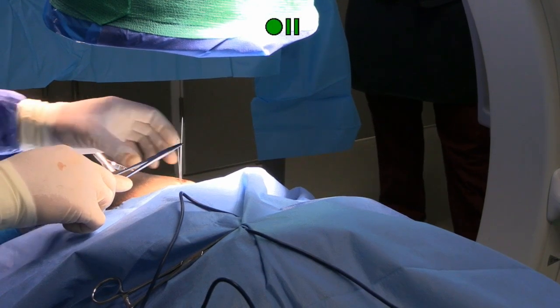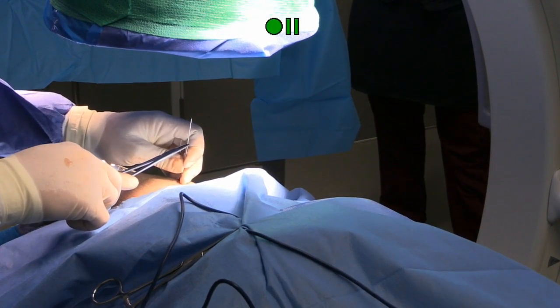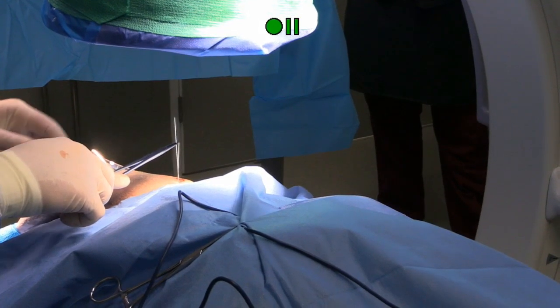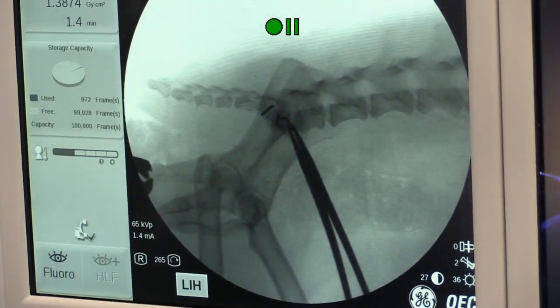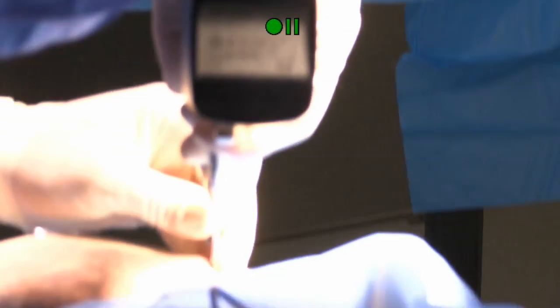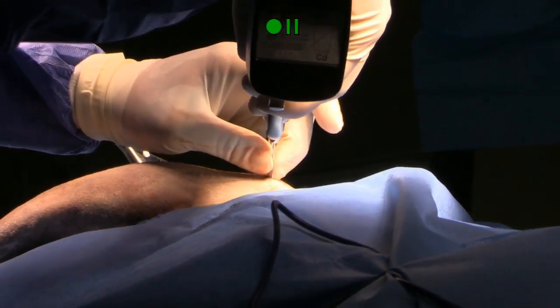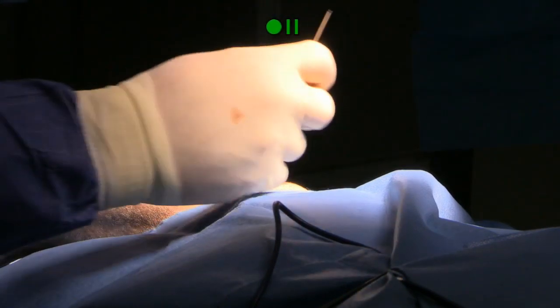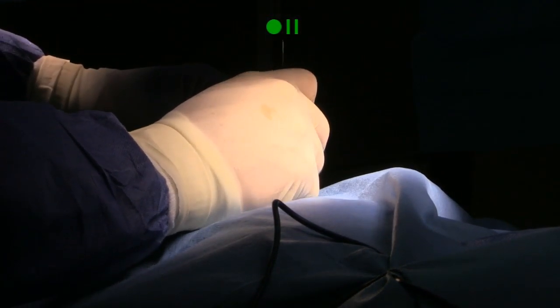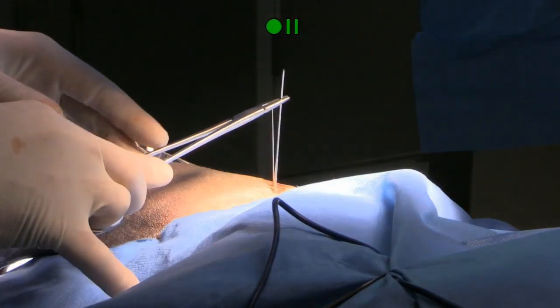that we're okay. And remembering the target I'm aiming for is only about 7 millimeters in size, and we're putting a 3.5 screw down there. So that's a big screw relative to the size of the sacrum. Having these other pins in as a reference makes it a lot easier for me to know where I'm going with these other ones.